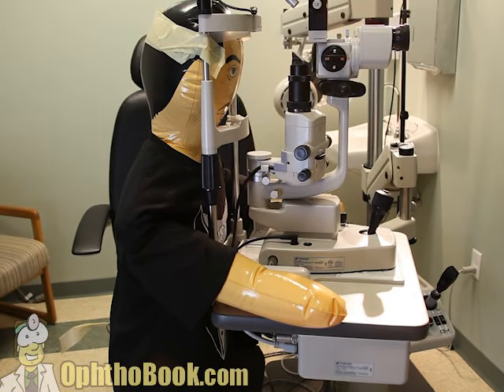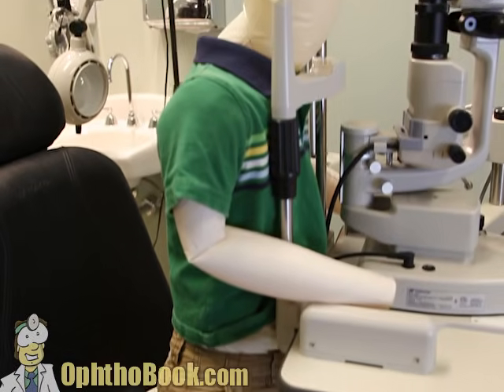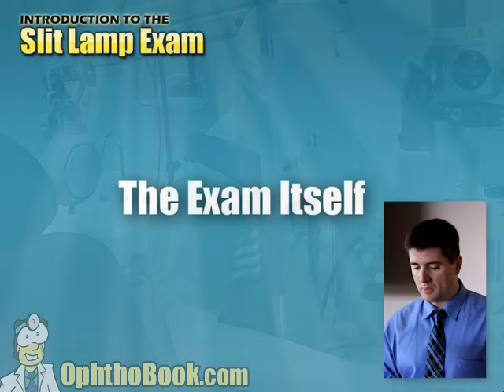microscope. And of course, with children, they're very limber, but they have short torsos, and so it's helpful to have them get on their knees and then get up to the microscope that way. And a lot of kids do great with this.